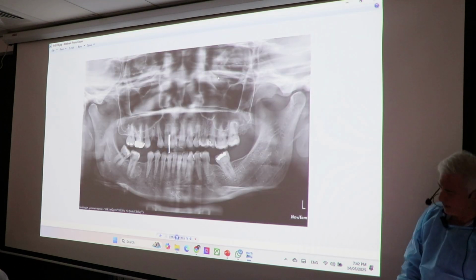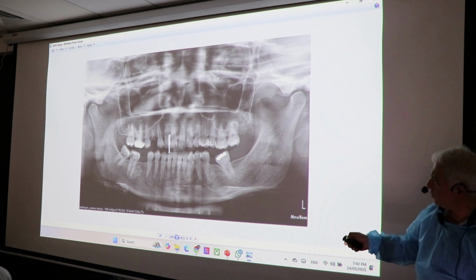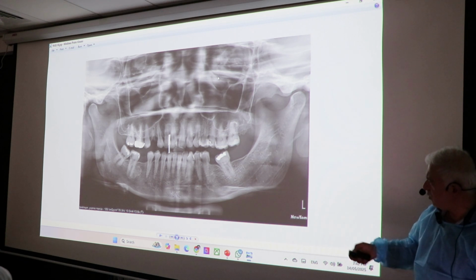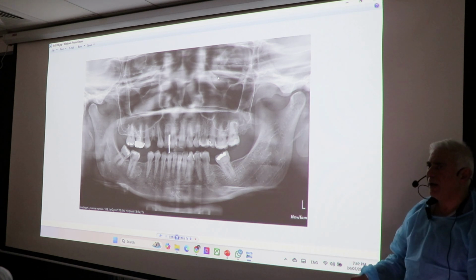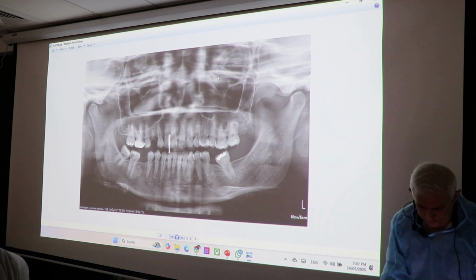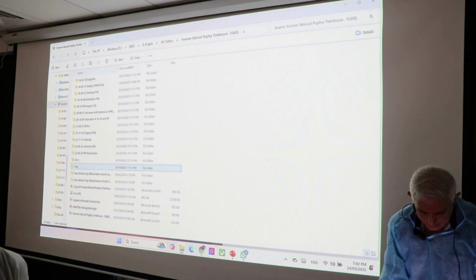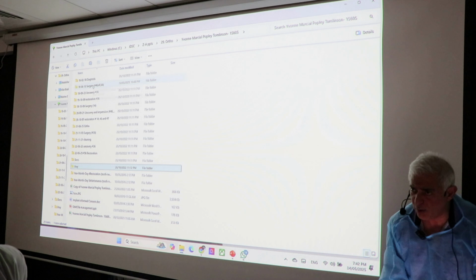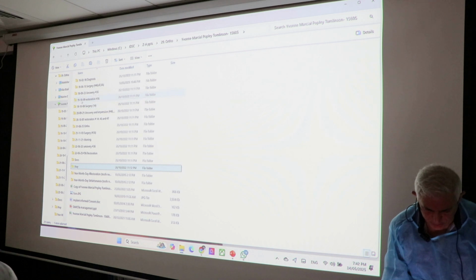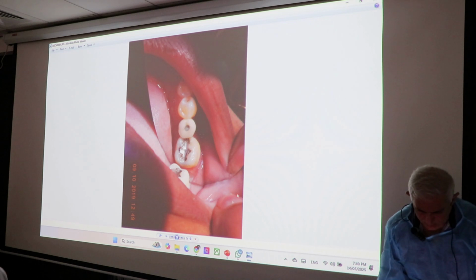So the patient comes like this, and this tooth is decayed. So 2 implants, an extraction implant with maybe a touch of sinus lift, and because of the inability to upright the molar, the surgeon decided to use a small implant or a mini implant. Do you want to see the surgery or only the complication? We have 15 minutes. I think we should go to the complication because the restoration was done, all good.